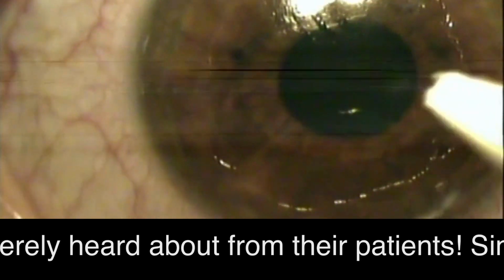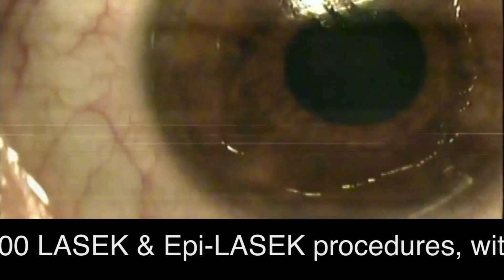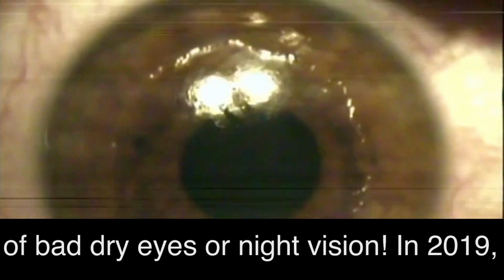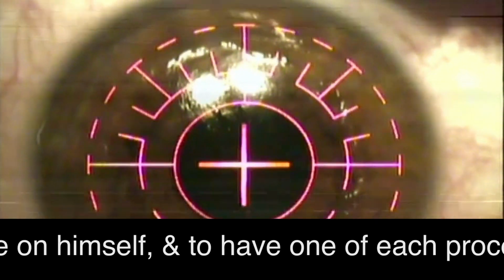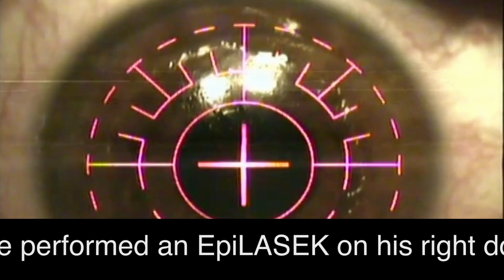It's a brand name for the cellulose sponge to clean up the eye. And then you're going to see I'm going to center the laser and start the procedure. So you can see a well done LASEK or alcohol assisted PRK is a much quicker recovery and much less pain and less chance of scarring than a regular PRK, just because it has cleaner edges and it heals quicker.